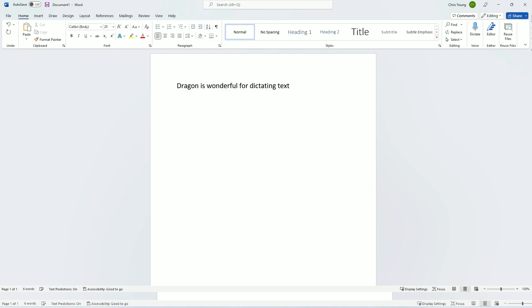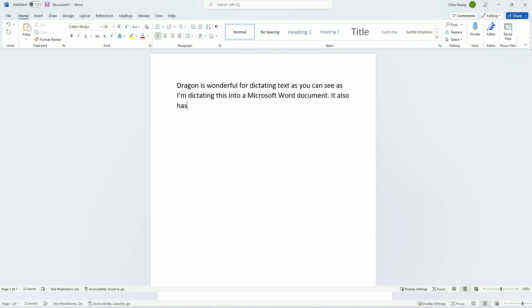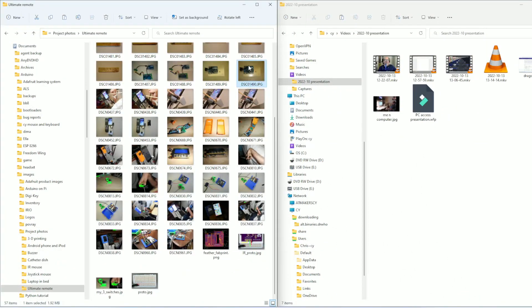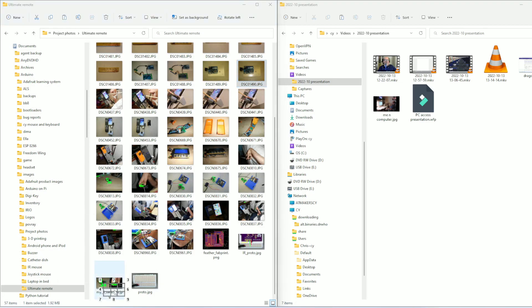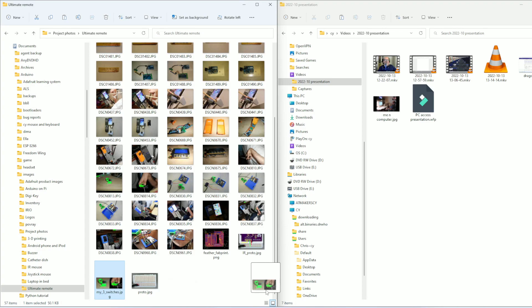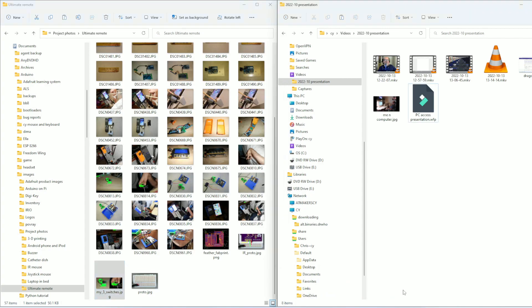Dragon is wonderful for dictating text. As you can see, I'm dictating this into a Microsoft Word document. It also has some limited mouse control features. Here I'm going to use mouse commands on Dragon to drag and drop a file — using commands like 'Mouse 7, 8, 3, Click, Drag mouse right, Stop.'